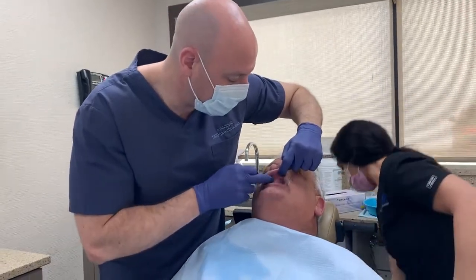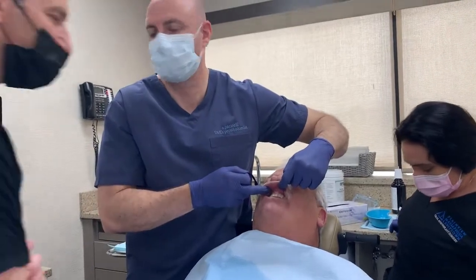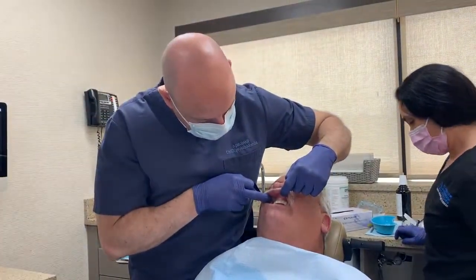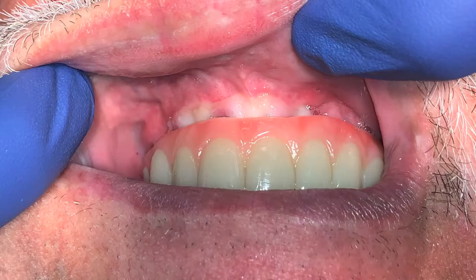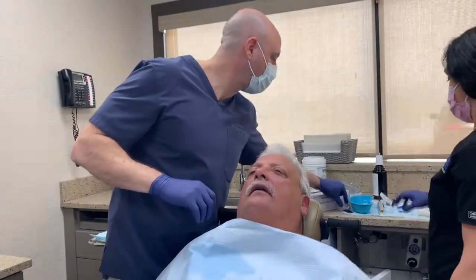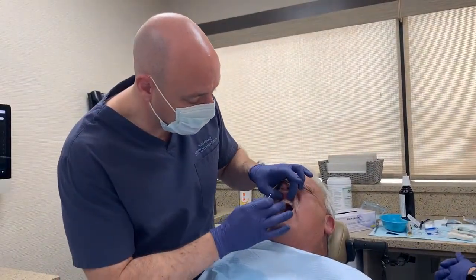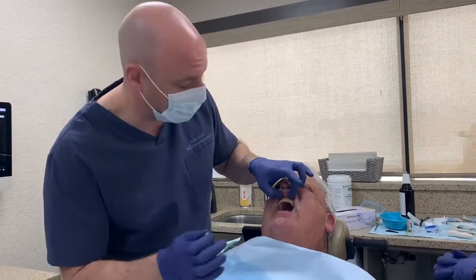Does it feel a little tight up here? A little bit. So if you notice here, it's blanching. Yes, this tissue is blanching in the anterior. If you're getting a little blanching, I would prefer to monitor that, to be honest with you. Like take down on the base a little? Yes, exactly. What do you usually do that with? I'll just use an acrylic burr for this, and then I'll put it on my wheel.